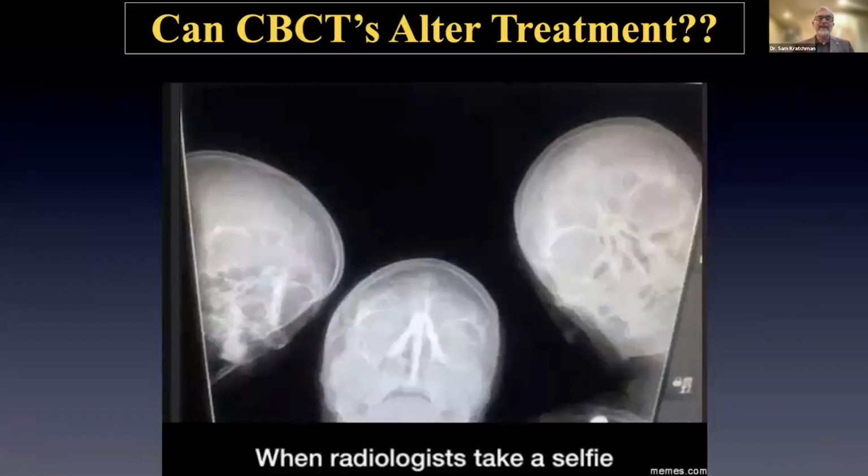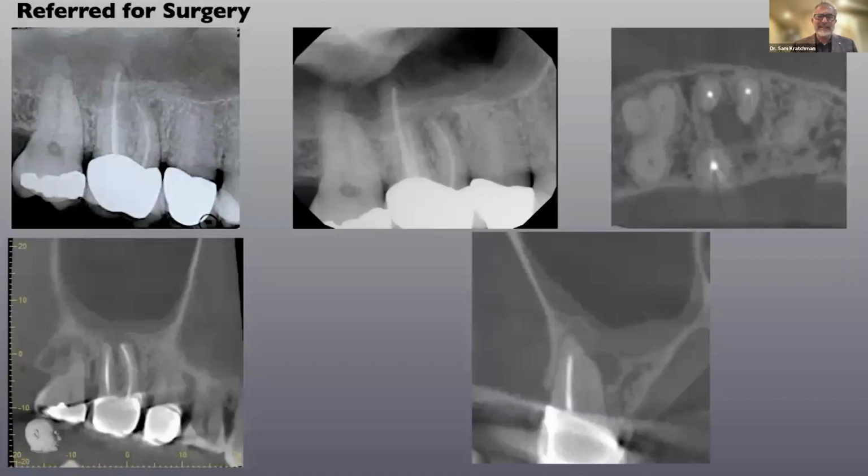Okay, next topic. Let's talk about how cone beams actually change my treatment plan on cases. Let's take a case like this. Patient came in, and this is also from an old faculty member of mine, an older gentleman, an endodontist, who does not have 3D technology. He did nice root canals, but if there were any problems, he would send them to me for either retreatments or surgery. So he does this root canal. This is his regular periapical film. Here's my digital film. Nice job.